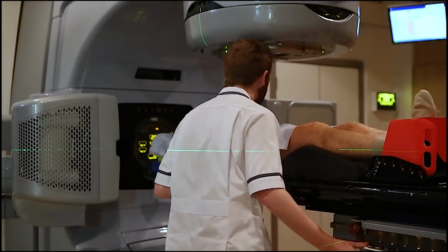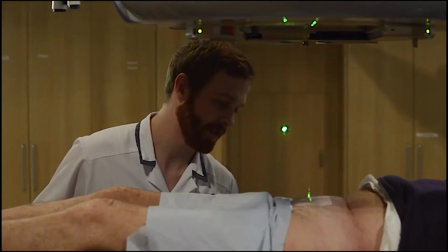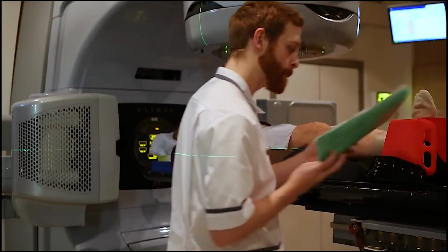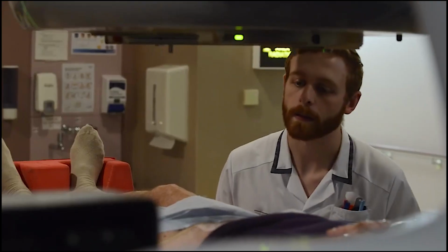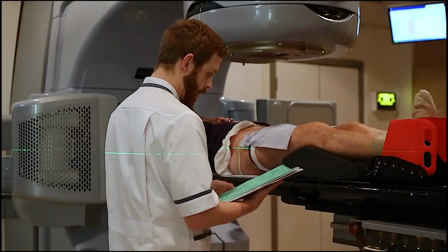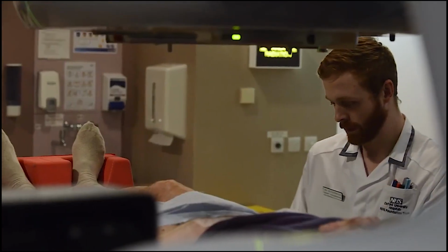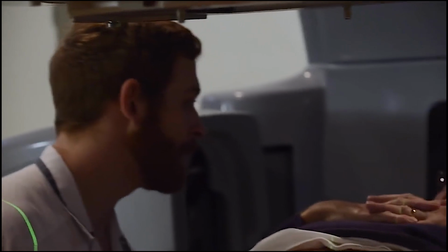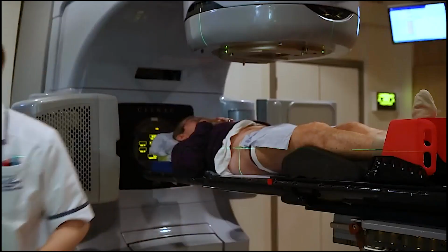You're raised up into the air, and you hardly even know it's moving. You know, you're laying on the bed and somebody speaks at your ear and you look to the side and the nurse's head is level with you, so you've gone up in the air, but you don't really feel it, or I don't feel it even moving. You'll be hearing us reading some numbers. Ignore the number again. This is a technical number we are reading from your paperwork. Basically, from the marker we are moving the couch or the bed to where we want to treat.